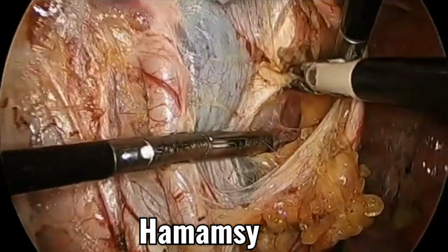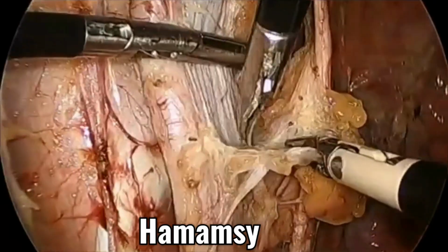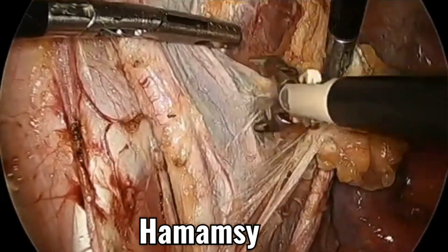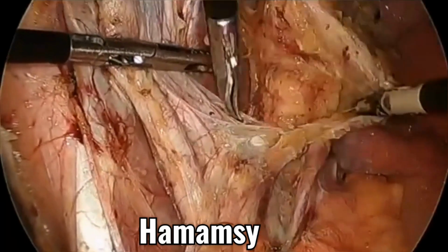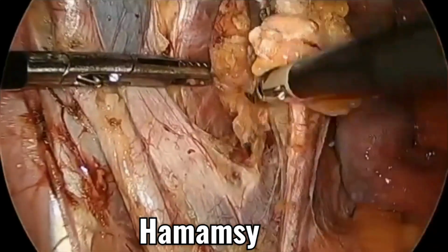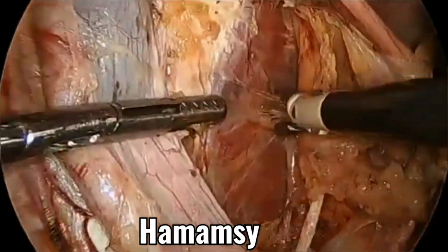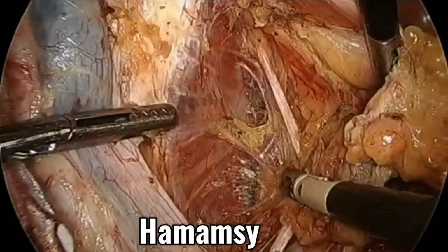اوكي. اهو ان بلوك. اهو ان بلوك. اهو ان بلوك. اهو toward the obturator fossa، وده الobturator nerve، وده الobturator lymph node.